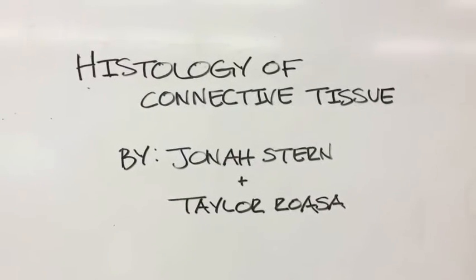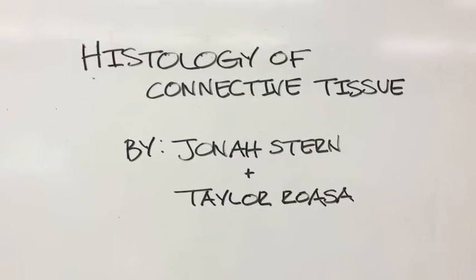The Histology of Connective Tissue by Jonah Stern and Taylor Roasa.